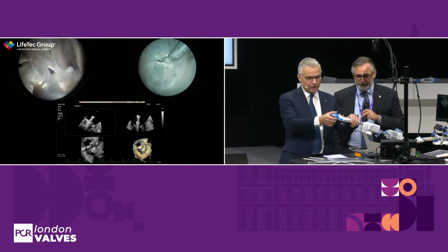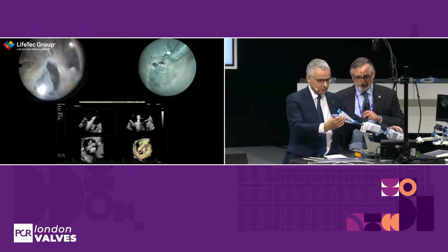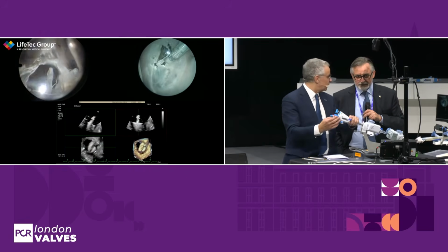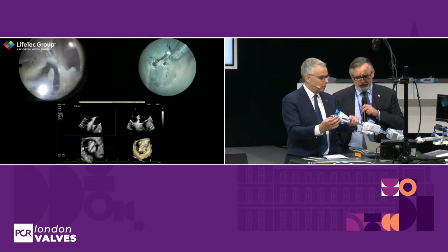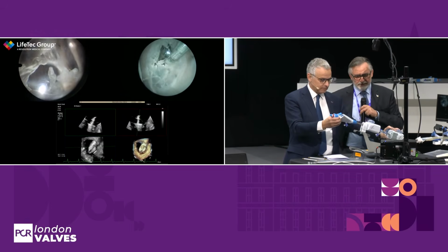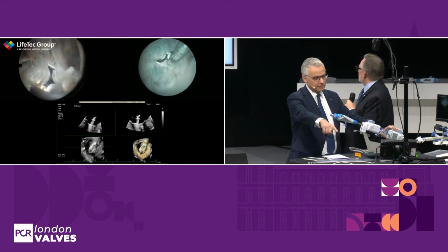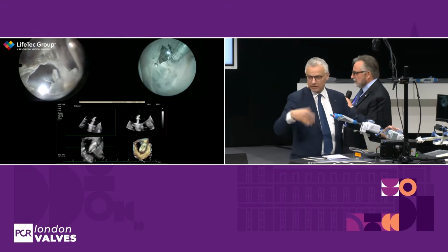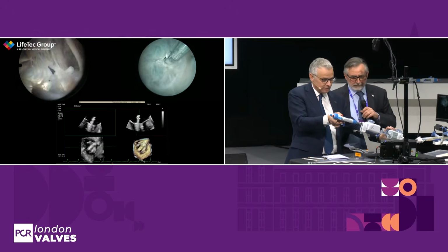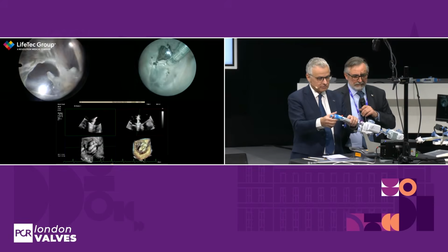zipping technique, we should align to the first clip, more or less like this. Correct? You can see the first clip there. Do you agree? More or less, yes. You are not perpendicular. You would be more like this. Yeah, you want to be more like this. Remove the camera. I don't need this camera. Keep the other one. Thank you so much. So you think it's better like this? Okay, yes. You agree? So we close the clip.